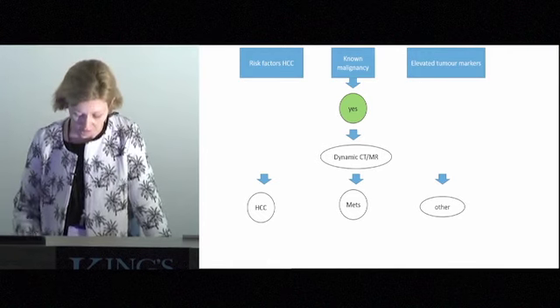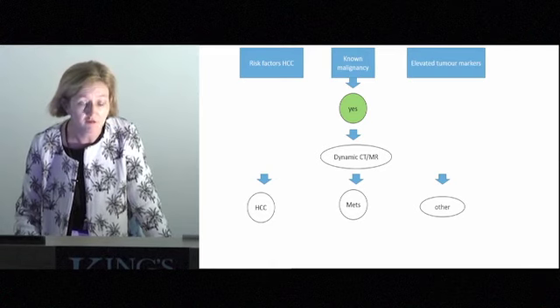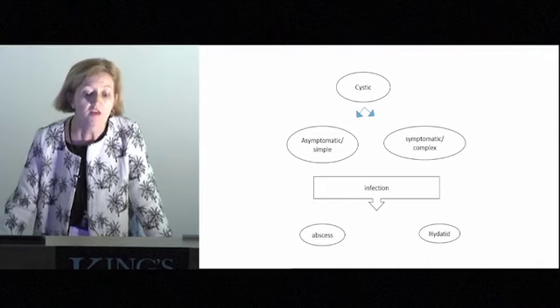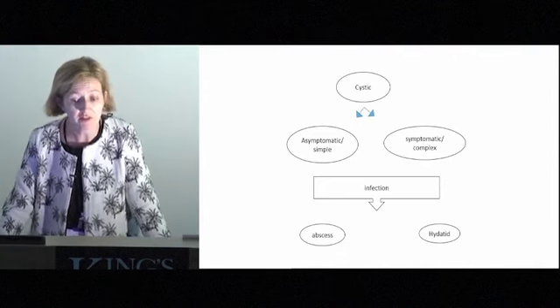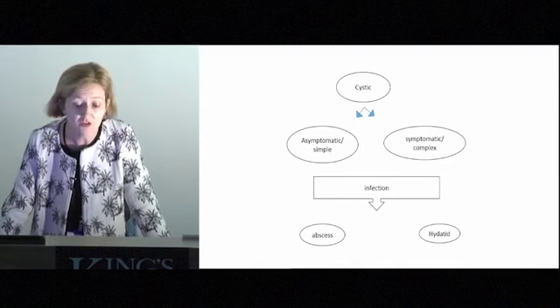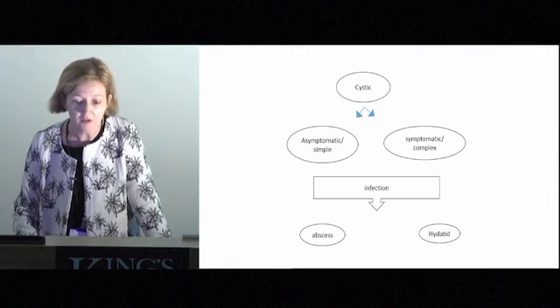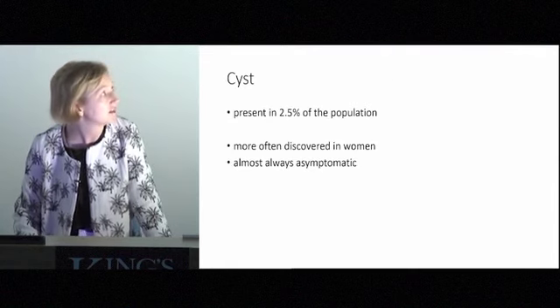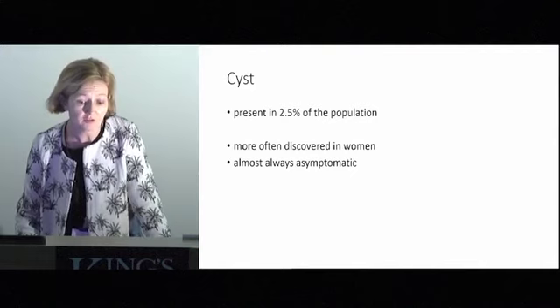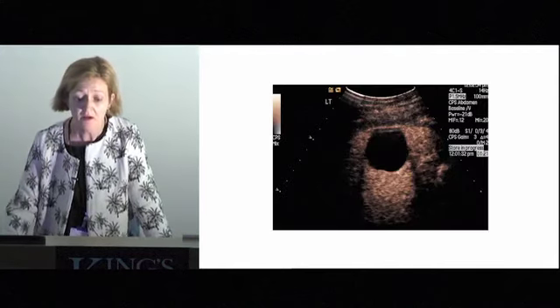I'm not going to dwell too much on these because it's not really under the remit of following up incidental liver lesions. They'll go for a scan to look for a primary or to characterise. If you come across a cyst, as you frequently do, and you're happy that it's a nice simple cyst, then that's fine. The patient needs no further follow-up. If it looks a little bit complex or worrying, then you can give some contrast ultrasound on the day and make your diagnosis. They're common lesions. You can tell the patients and send them on their way.